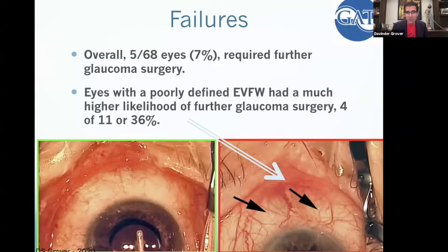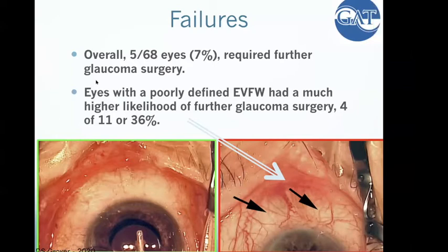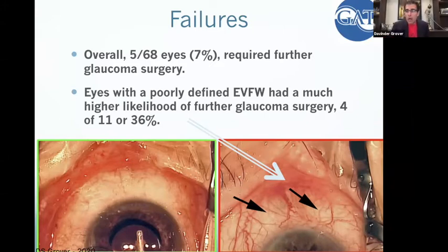That sounds like a really good way to use this information in real time in the OR to make a decision that's better for the patient. I have another question too. When you're doing that test to see the wave, you modified the height of the bottle? No. I just do the normal irrigation aspiration, but then I use a balanced salt solution on a cannula, and I physically pump up the eye to a pressure of about 25 or 30 to kind of see that wave.